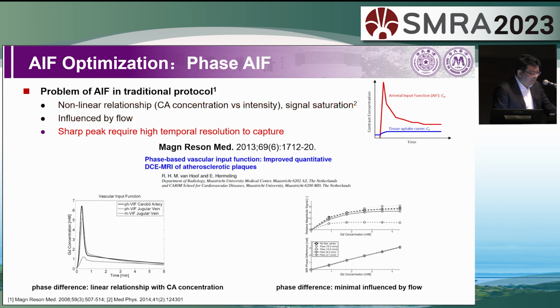So one solution is to use phase-based AIF, acquire phase to eliminate the nonlinear relationship with contrast concentration, and it can also reduce flow artifact.